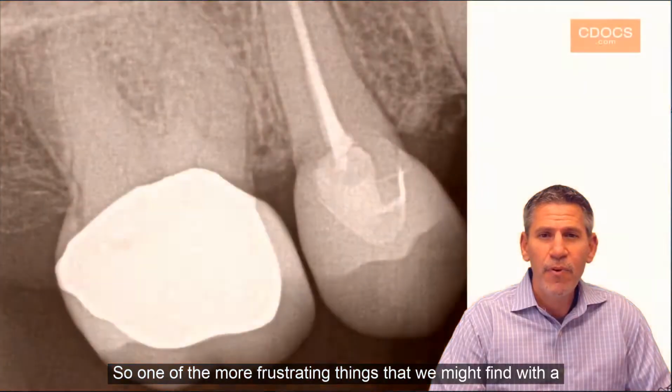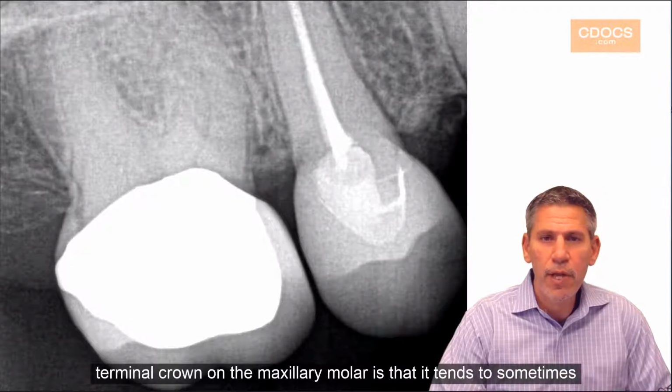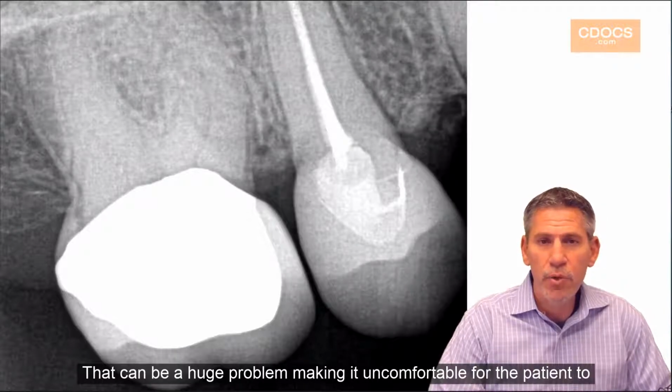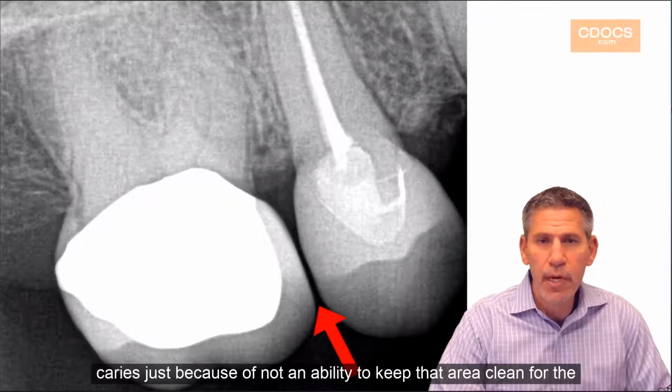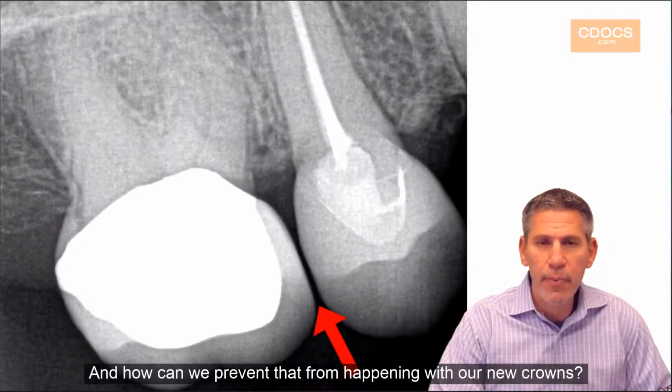So one of the more frustrating things that we might find with a terminal crown on a maxillary molar is that it tends to sometimes drift distally. That can be a huge problem. It can be uncomfortable for the patient to catch food, and it can certainly be an issue where we're developing caries just because of the inability to keep that area clean for the patient. So why does that happen, and how can we prevent that from happening with our new crowns?